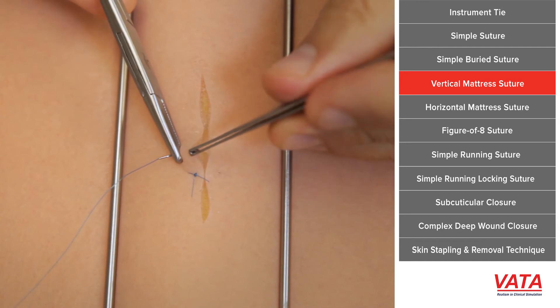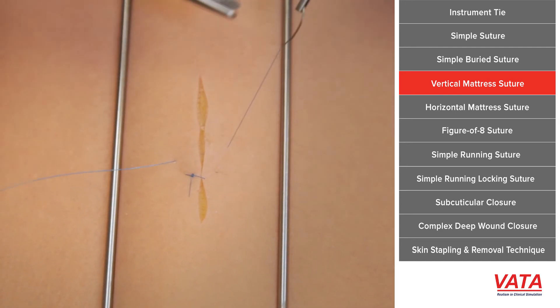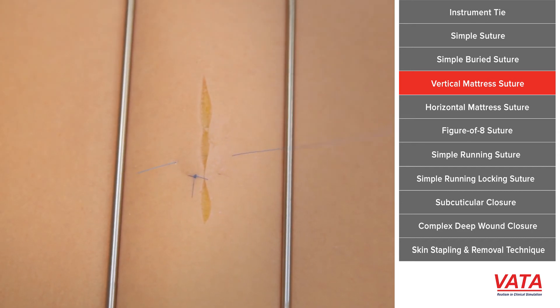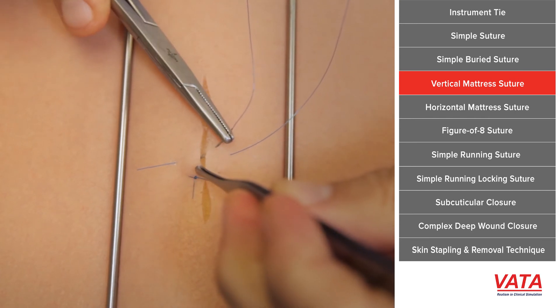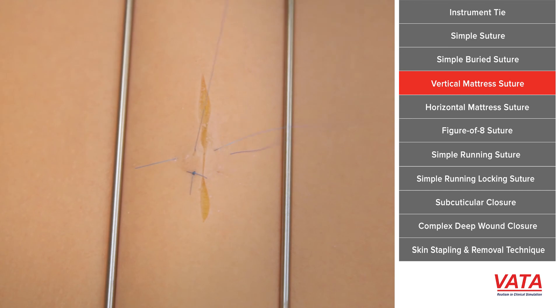So again, deep — run along the bottom of the dermis and come out about the same distance on both sides. Turn the needle around. And now you want to get pretty close to the edge of the skin, because it's the distance between those two bites that gives you your strength. Do the same on both sides, and then go ahead and do your instrument tie.